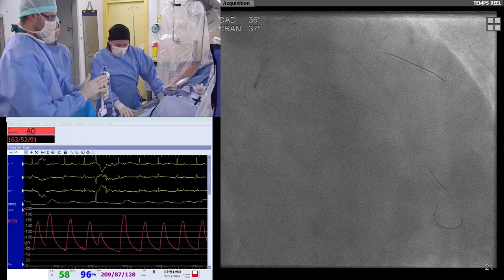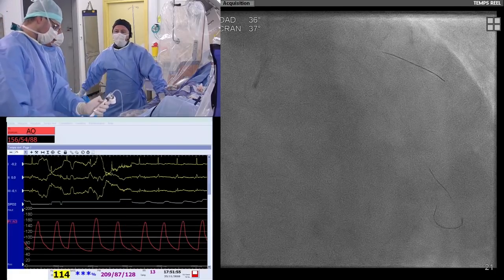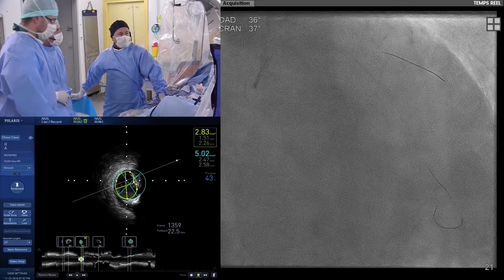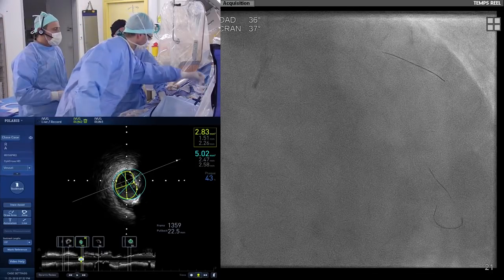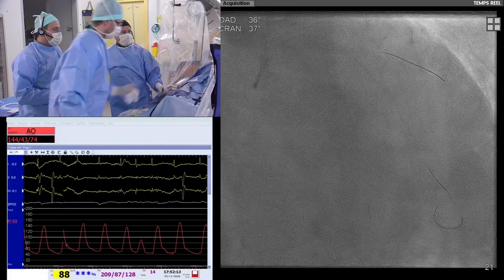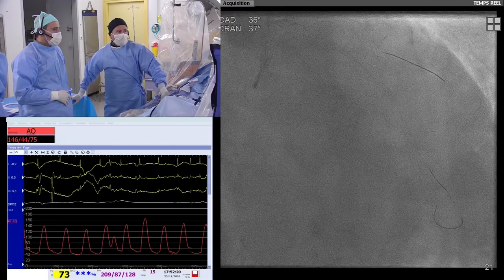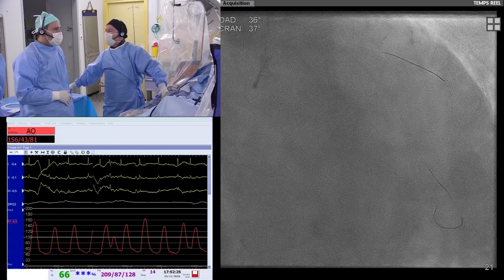As you can see, using the IVUS, the distal part is 3 mm diameter. So about the length, I think we can use a long stent, a 48 maybe. Yeah. And due to the long lesion, I think we have to treat the LAD and the left main with a full metal stenting. This is I think the best option. But we can discuss on that strategy.